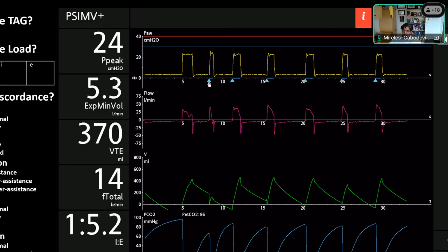I don't know if it's using flow, or pressure, or a combination of either. I don't know, Rob, if you know what the machine uses for that. I think that's proprietary. I don't think they describe it very well. Probably they will never tell us for now. But you can see that all these breaths have different sizes based on the trigger.